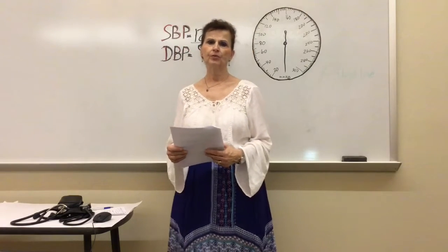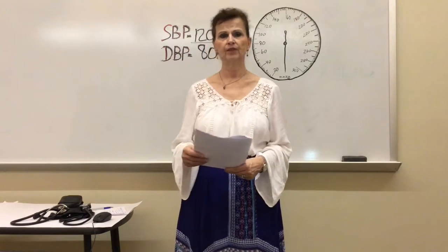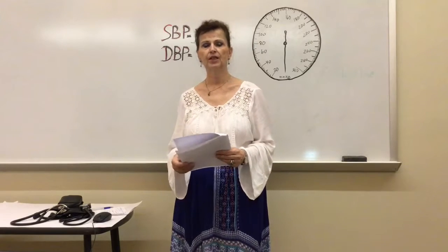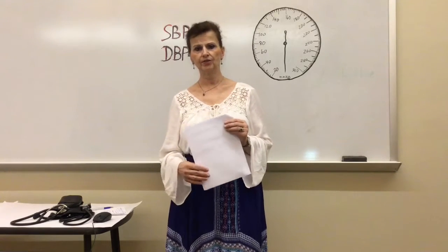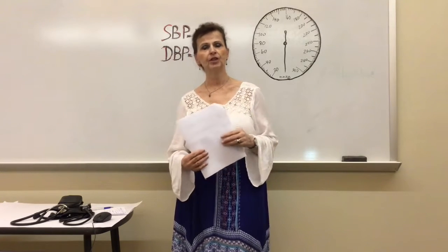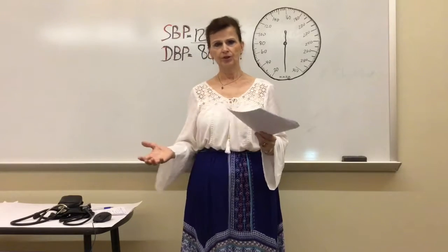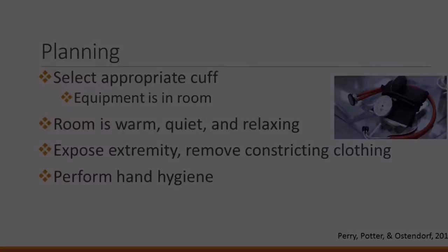Also, determine what the patient's baseline blood pressure is. Determine if the patient has a latex allergy, and if so, they've had a blood pressure taken before. Next, we go to planning.